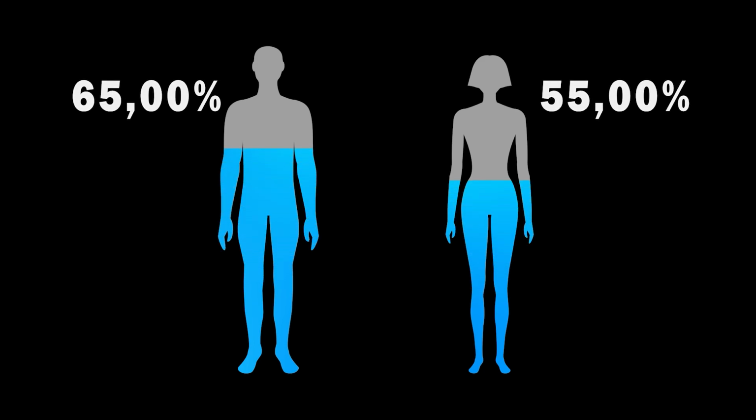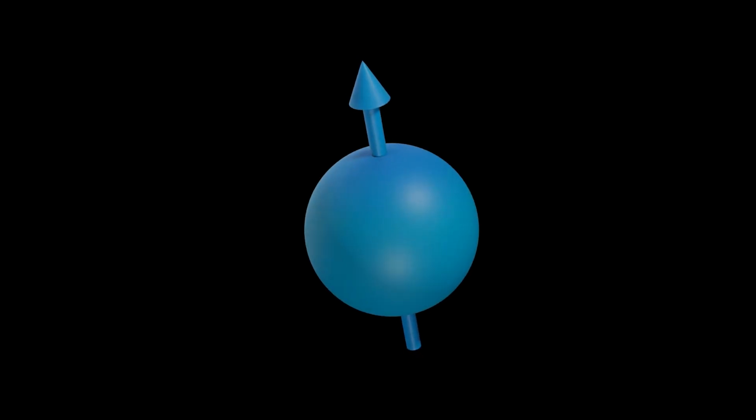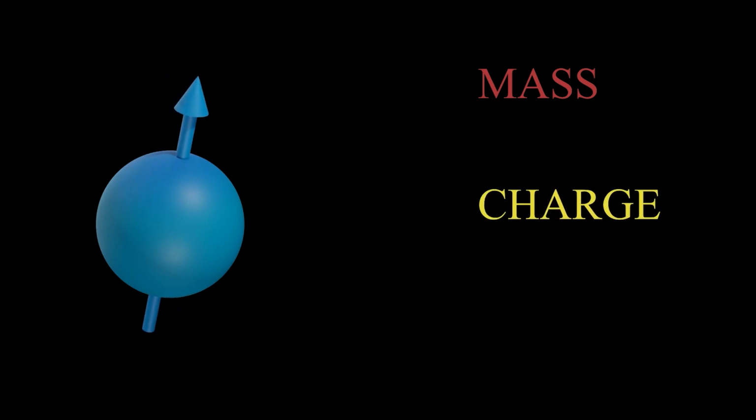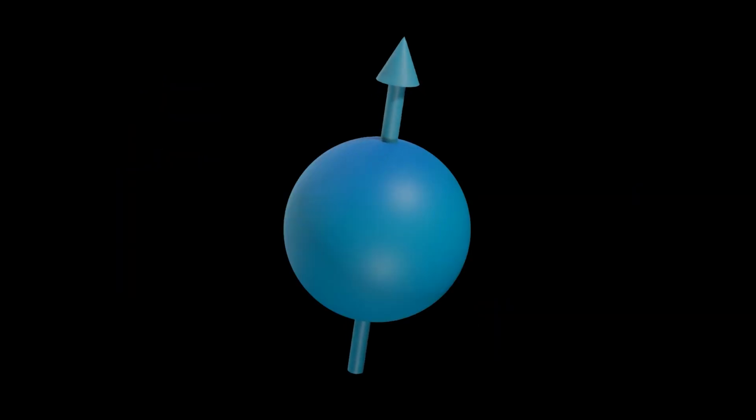These atoms have a remarkable property called spin. Just as mass or electric charge are inherent properties of subatomic particles, so is spin. We understand that mass interacts with a gravitational field and electric charge interacts with an electric field. Meanwhile, spin interacts with the magnetic field.